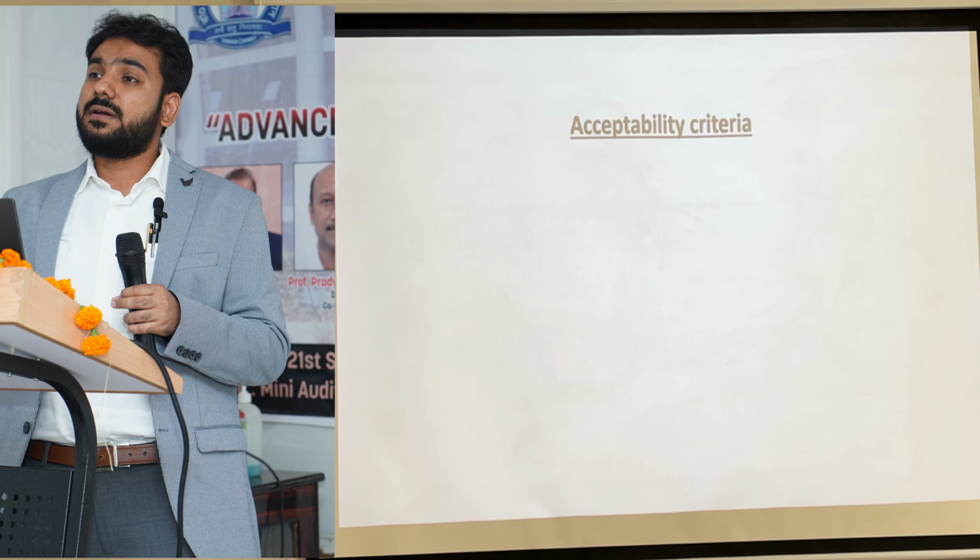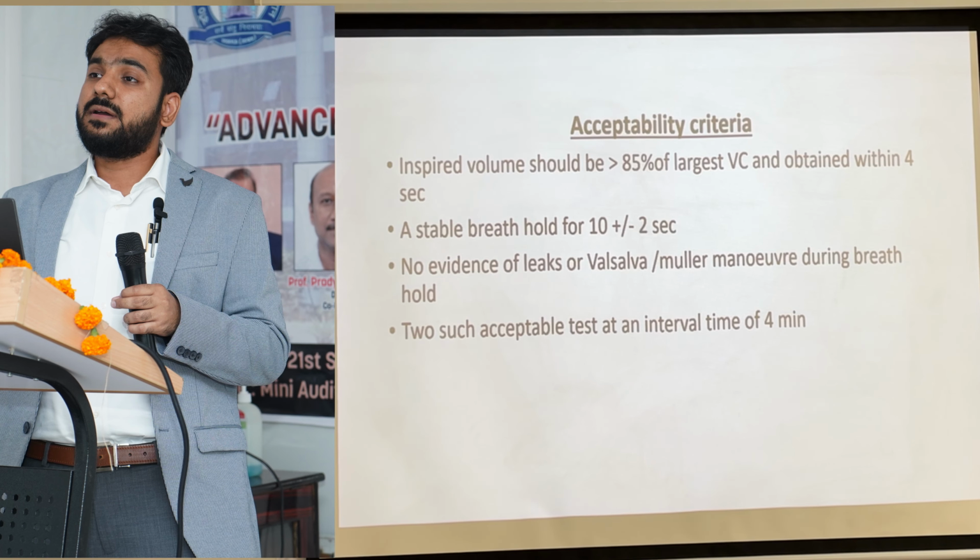Now, there are standard acceptability criteria which are given by the ERS. The inspired volume should be more than 85% of the largest VC, vital capacity, and obtained within 4 seconds. A stable breath hold of 8 to 12 seconds. There should not be any evidence of leak or Valsalva or Muller's maneuver during the breath hold, and there should be 2 such acceptable tests at a time interval of 4 minutes.